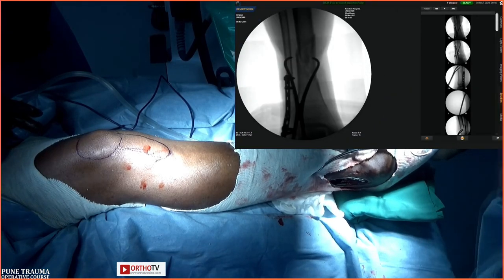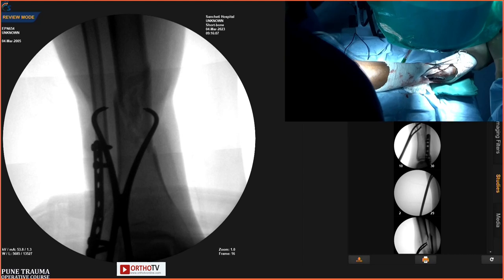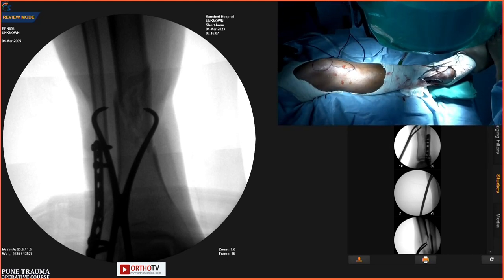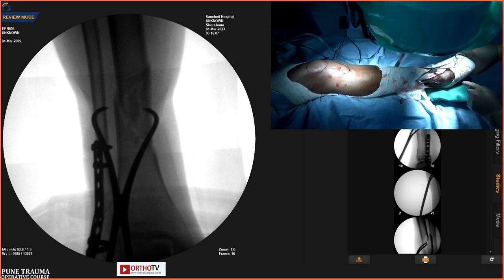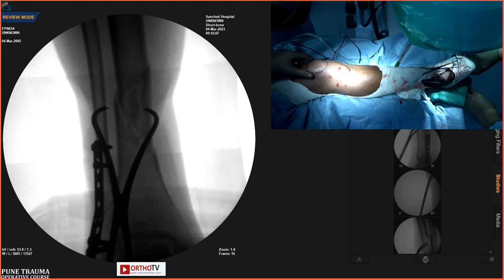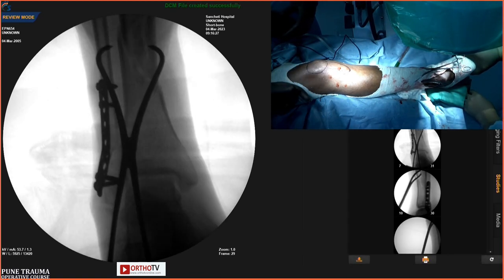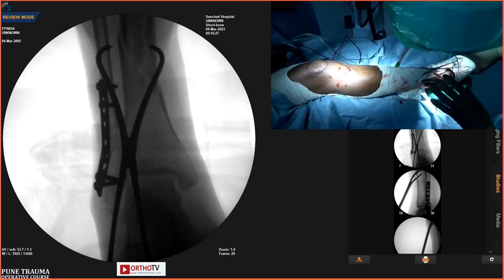So now we can see, sir. Shivshankar sir, see my reduction. It's a clamp assisted reduction. Are you happy with the reduction? Yes. Good. And you can see the ankle plafond also. Now I think it's horizontal. Milind, do you see this thing? Yes, sir. So I have done a clamp assisted reduction.